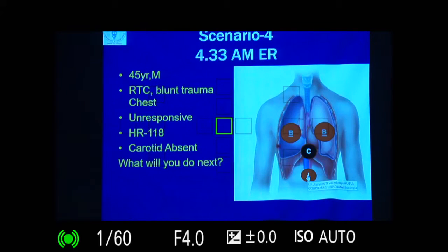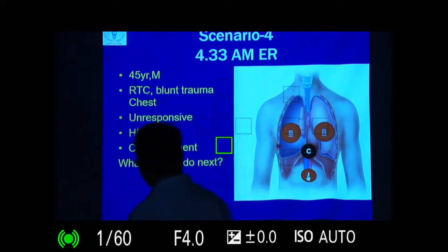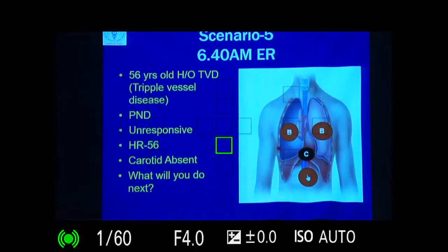It can be due to tension pneumothorax. You understood, all of you? So, if there is absent lung sliding on the left, check on the right side, check whether the tube is in position or not. If it is in position, say a size 7 at 21 or size 8 at 24, and you find it is still in the center and the left side has absent lung sliding, that is due to tension pneumothorax, okay, put in a needle. I will go to the next step, that IVC will be dilated in that case.